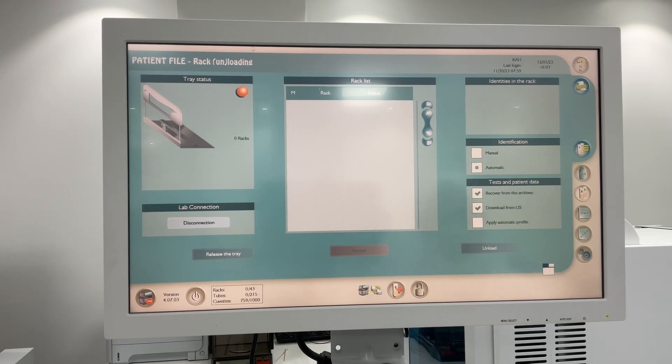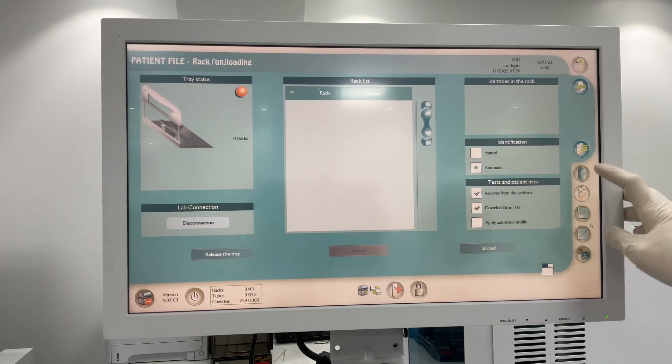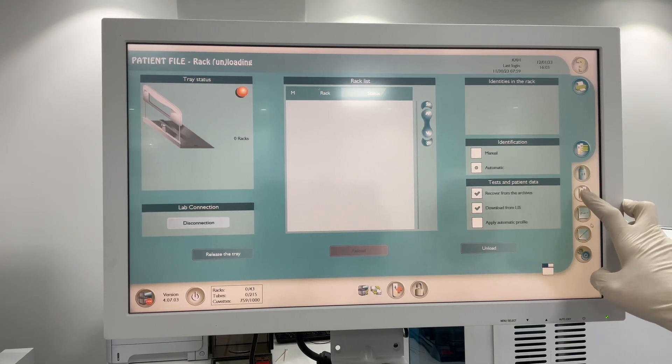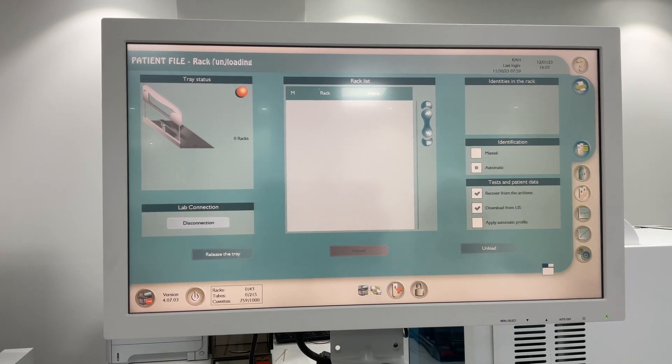After maintenance, you can now run your controls. This is the control, calibration, and settings. Here is your sample insights for analyzing ongoing testing, and this is your reagent. Click here for your QC.